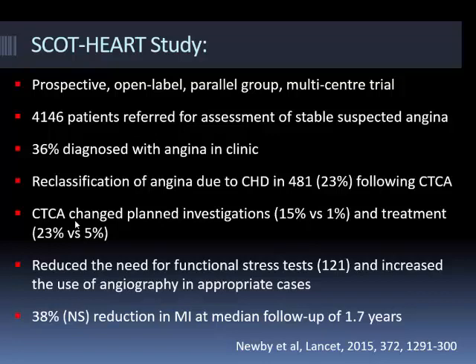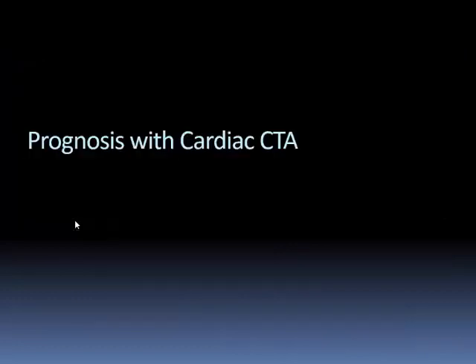And what they found by doing CT angiography is that you would potentially redefine the diagnosis in about 20% of cases. In other words, cases where you didn't think this was angina, you would rethink, and cases where you thought this is angina, you would reconsider to this isn't angina. So that was potentially of use. It also resulted in fewer cases going forward to angiography who didn't need angiography. So it's a very nice study and worth having a look at.